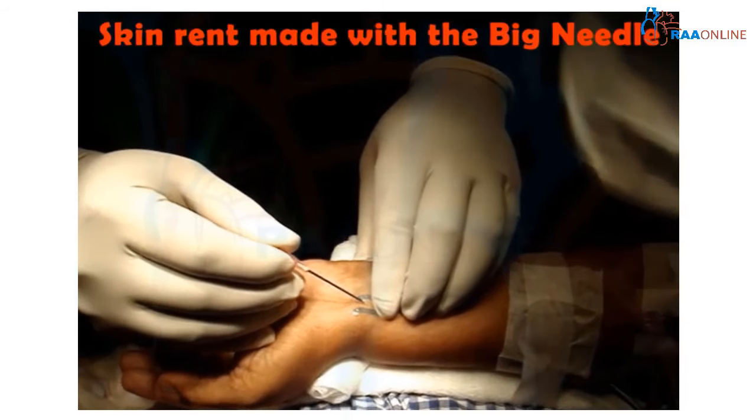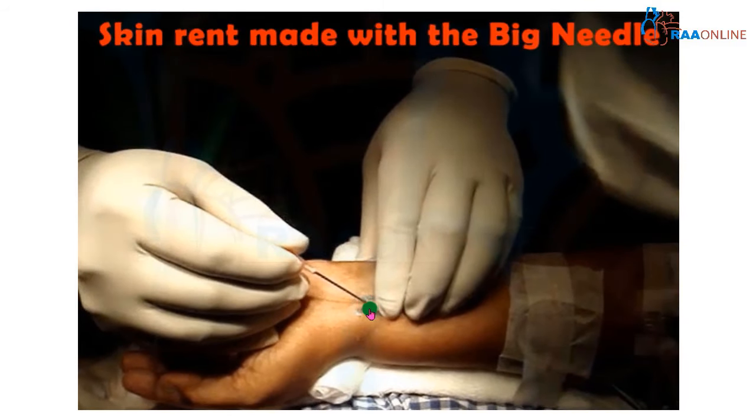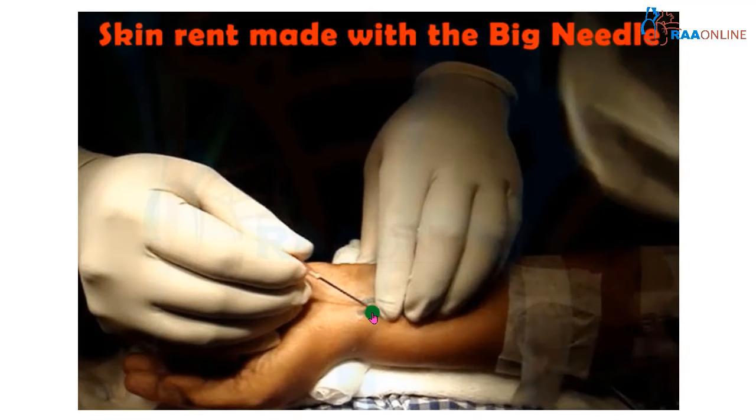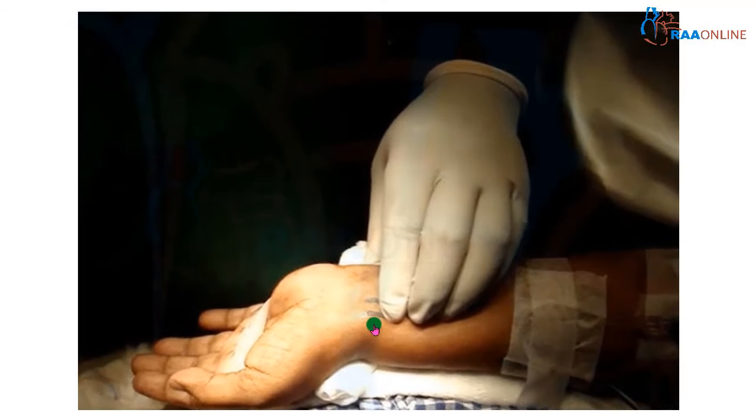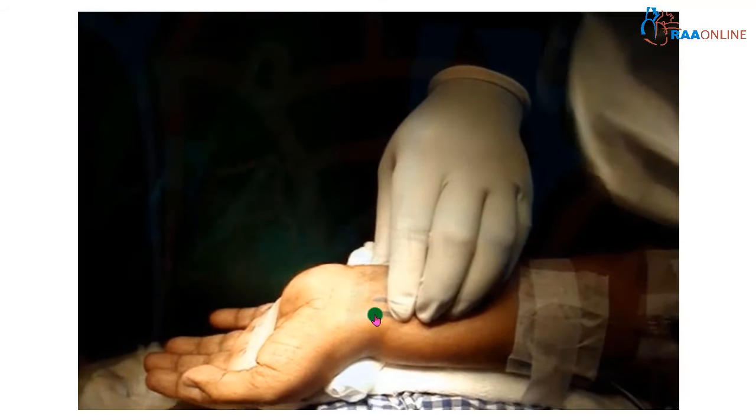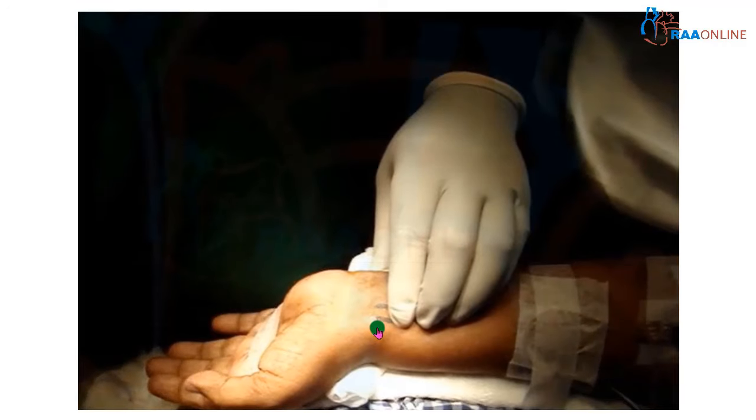Another important point is enlarging the skin rent with a larger, broader needle. This hole made with the bigger needle helps to place the catheter along the needle without any shearing of the distal tip. You can see a puncture is made up to the subcutaneous tissue, and through this rent the needle and catheter will be passed.